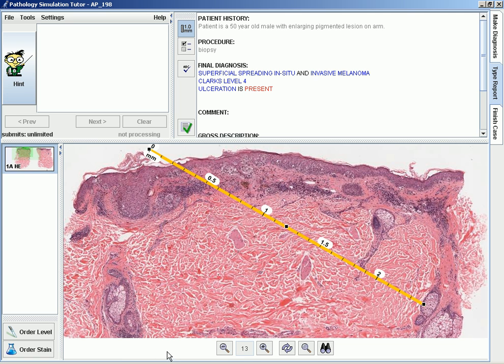And when I release, as you can see, it's just a ruler. If you don't like where you initially placed the ruler, you can change it. You can lengthen it, shorten it, or whatever. Just hold down the left mouse button on one of the end points, and you can shorten it, lengthen it, you can rotate it around, you can do whatever you want. You can do that with either of the end points.